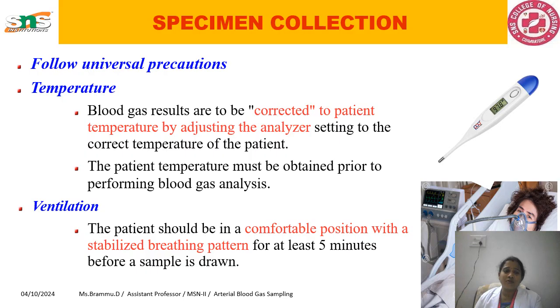So after that, what we have to do during the procedure is always strict hand washing, and along with that you follow the universal precautions. So the universal precautions is that the other important thing is that before you take the sample is temperature.